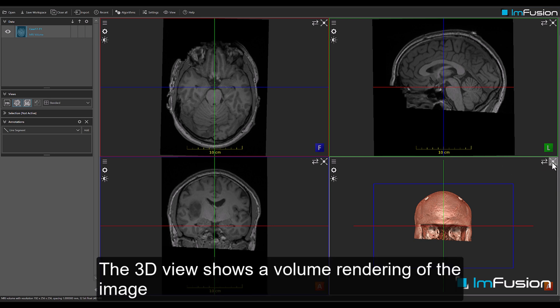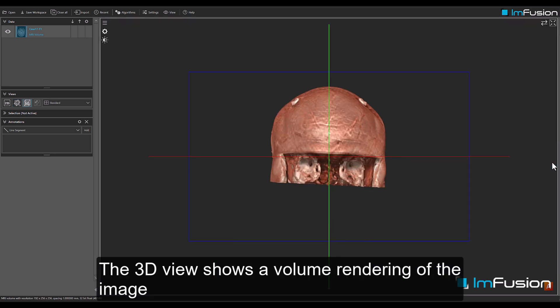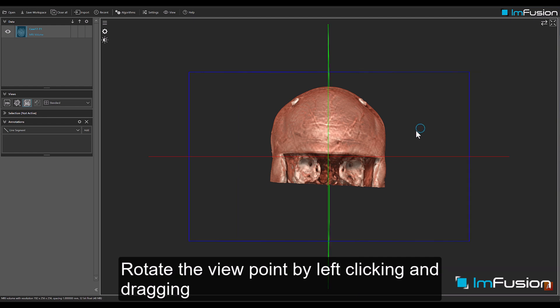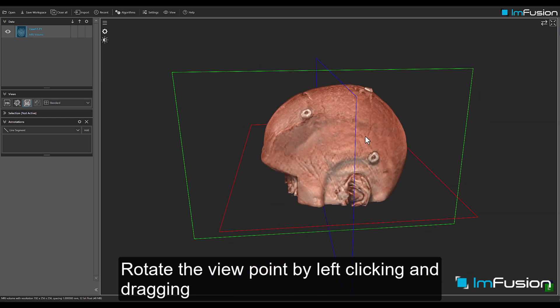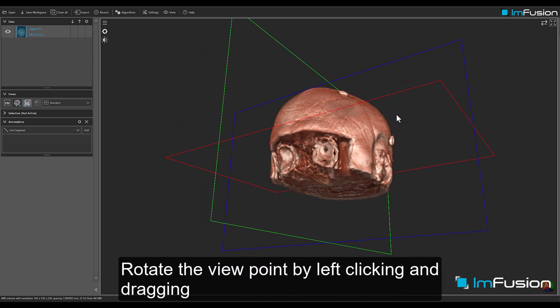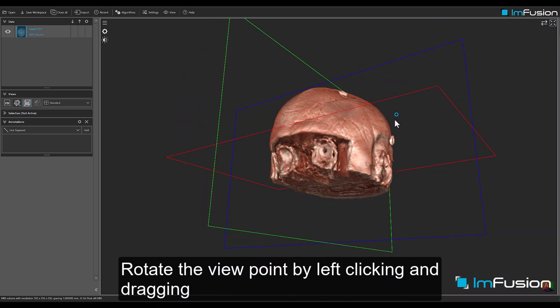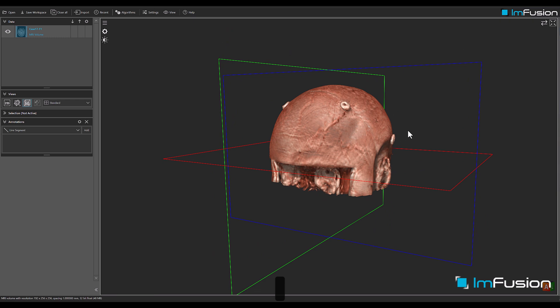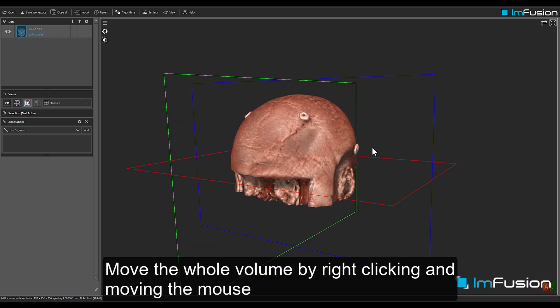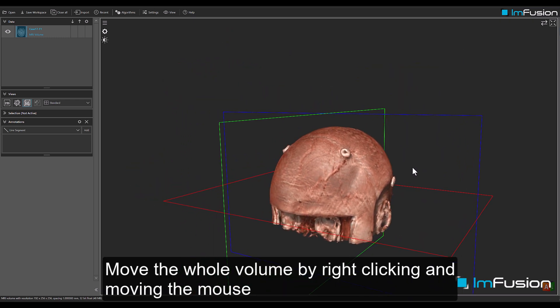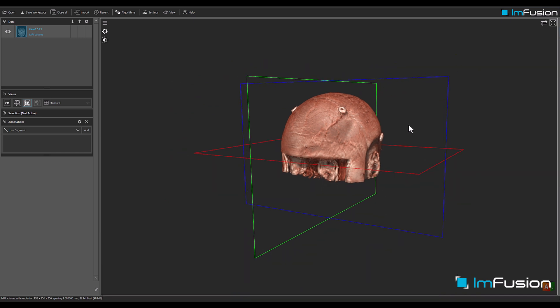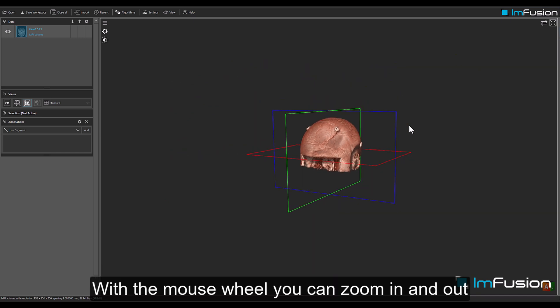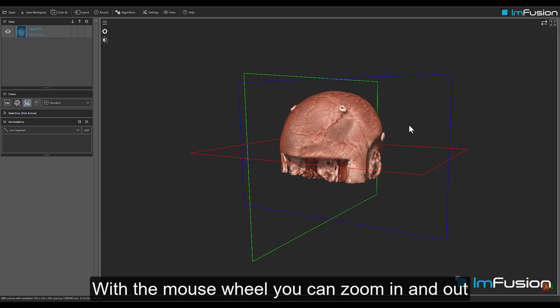The 3D view shows a volume rendering of the image. Rotate the viewpoint by left-clicking and dragging. Move the whole volume by right-clicking and moving the mouse. With the mouse wheel you can zoom in and out.